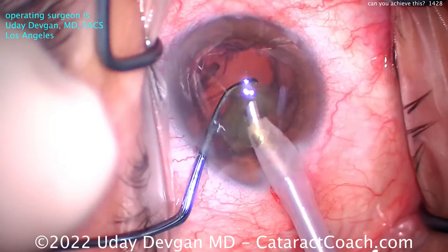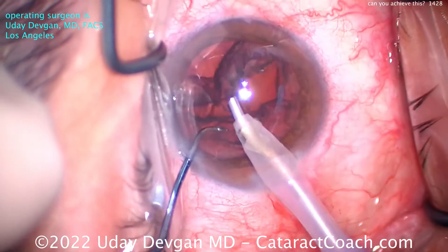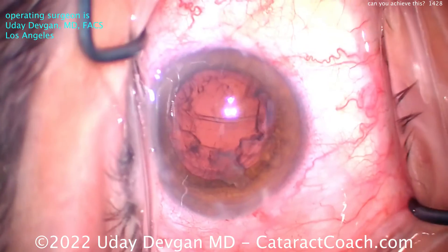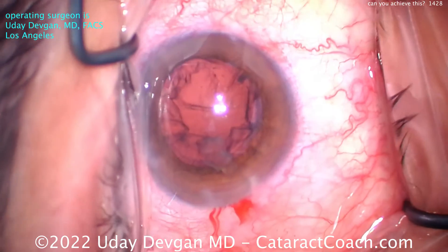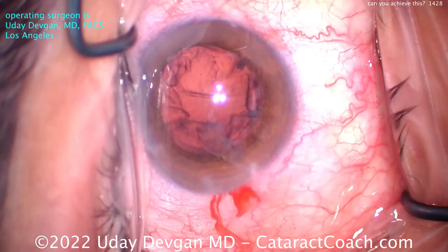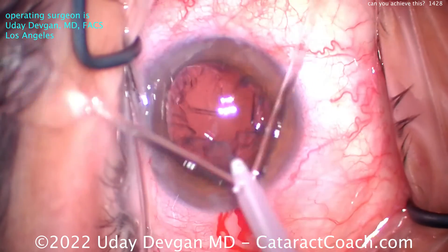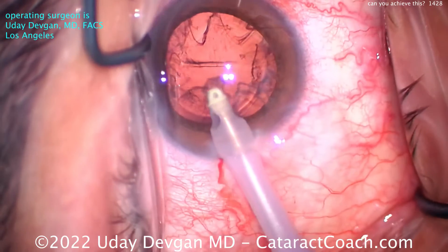This is a basically moderate nuclear density — pretty typical category that you'd find here in the USA. Just like that, we'll get out the epinuclear shell as well, and now all that's left is cortex. Pretty efficient — only about two minutes into the surgery and the nucleus is already out. Don't worry so much about the speed, but worry about the ballet of it. No wasted motions, pretty things that just flow really well.